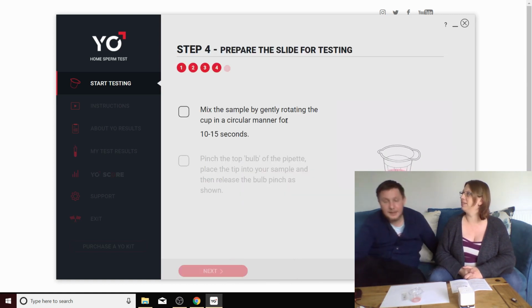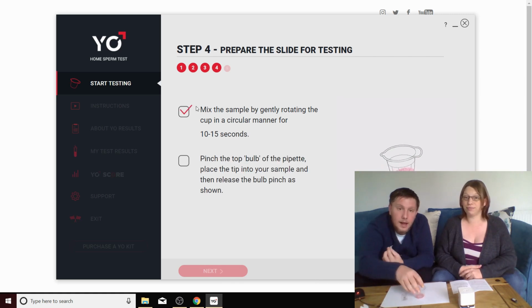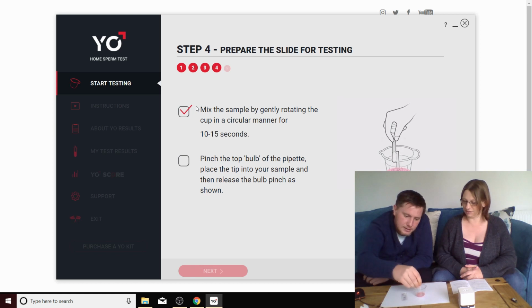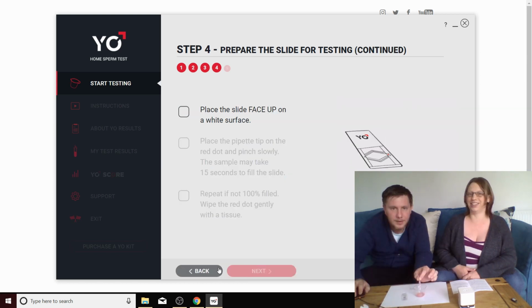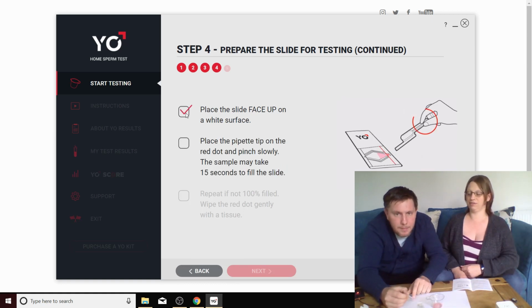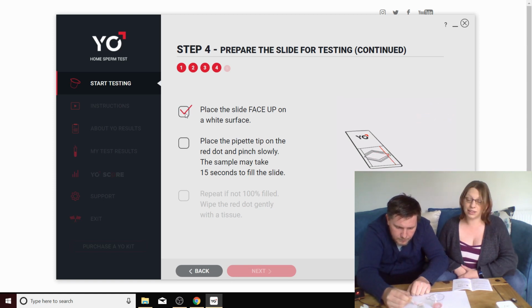Okay, next. So now we're on to the important, exciting bit. Mix the sample gently for 10 to 15 seconds. And pinch the bulb of the pipette. Place the tip into your sample, then release the bulb, pinch as shown. So in and release into the sample. Place the slide face up on a white surface, which you've done, haven't you? Yeah. Place the pipette tip on the red dot and pinch slowly. Sample may take 15 seconds to fill the slide.